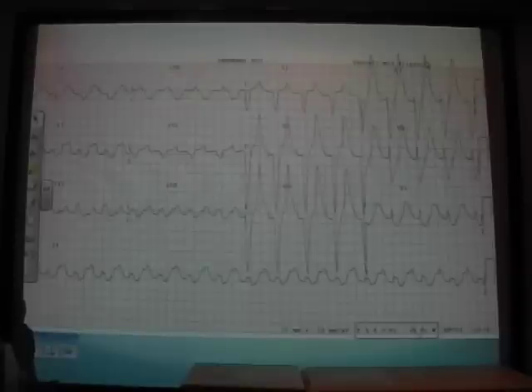Now, is that a P wave? I think actually this here is the P wave. This is the Q. Right, a nicely slurred QRS complex. So if I circle here, this one, no, massive T wave. So we've got a really abnormal ECG.